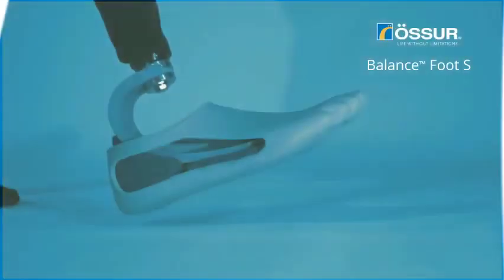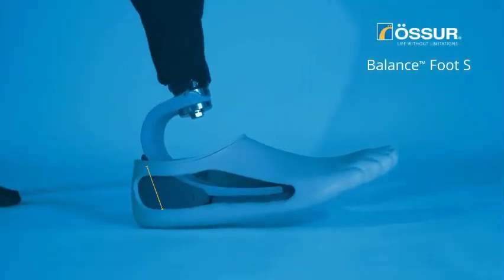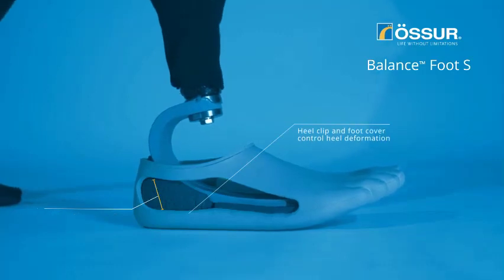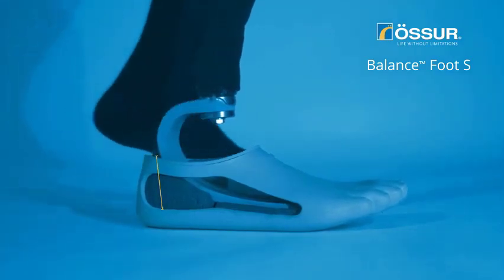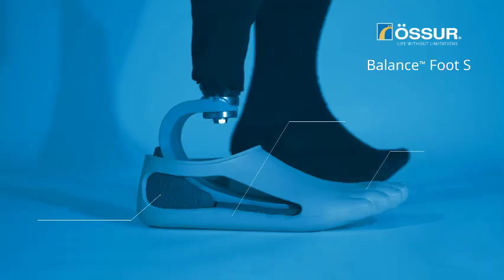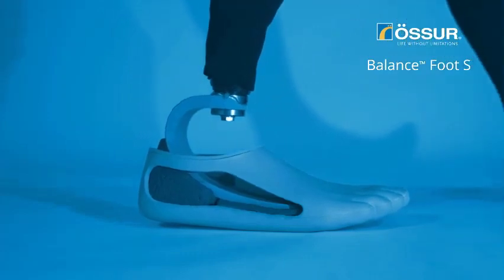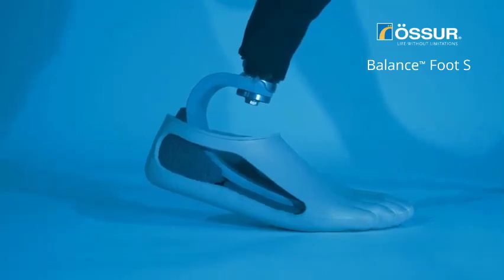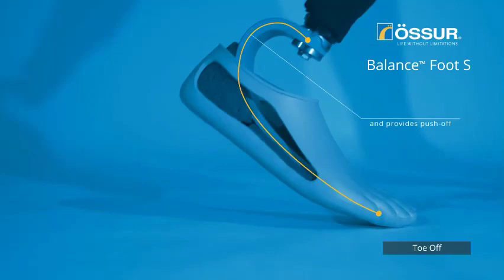Running through the video showing what happens during the gait cycle with the Balanced Foot S: at loading response, we get a quick heel compression from the heel foam, and the heel clip and foot cover control heel deformation. Going into mid stance, we get progressive stiffening of the heel providing tibial progression, a natural progression of the center of pressure, and the split toe and toe foam provide multi-axiality. In terminal stance, the C-shape design stores energy, the wide foot blade offers stability, and the full-length toe lever supports ankle motion and assists with push off. At toe off, energy is returned from the C-shape, providing push off to the user.